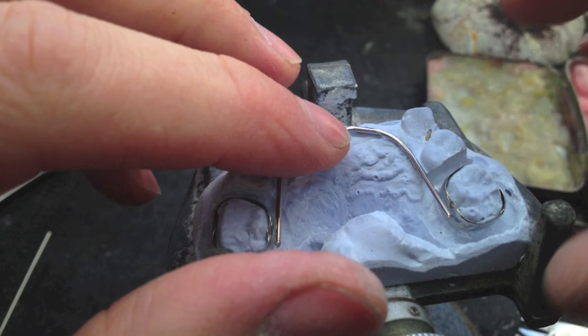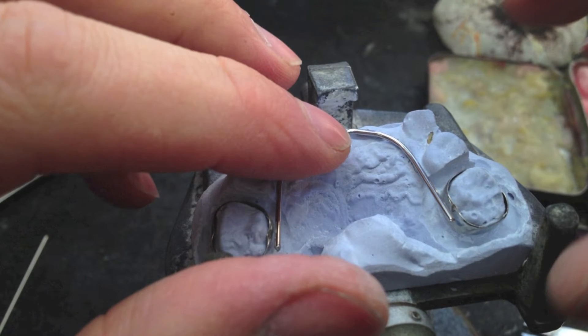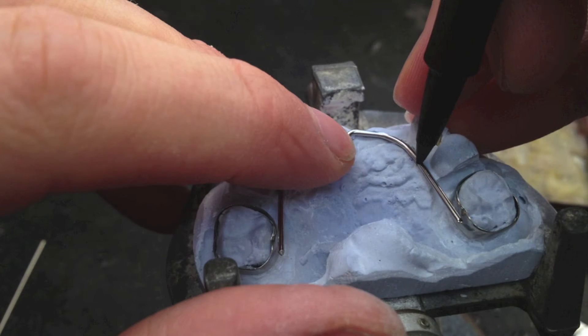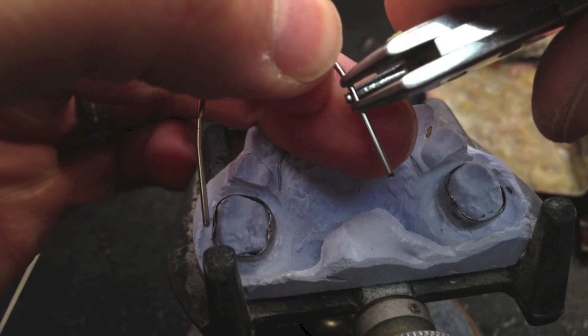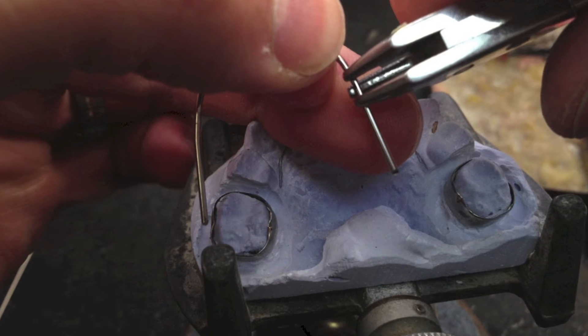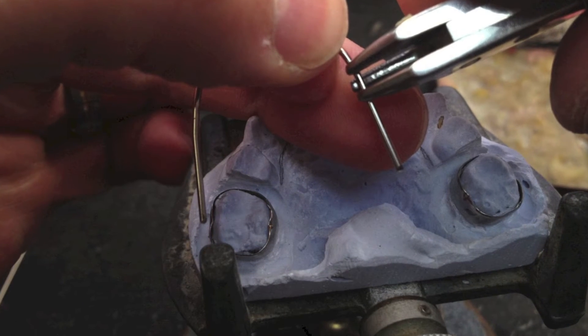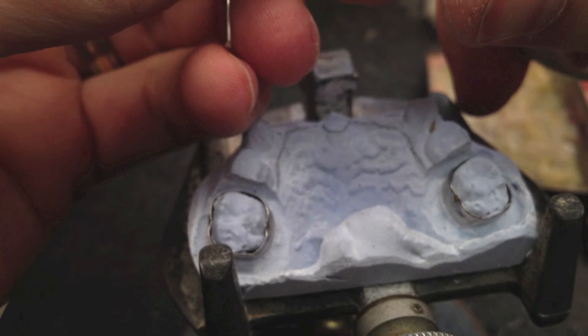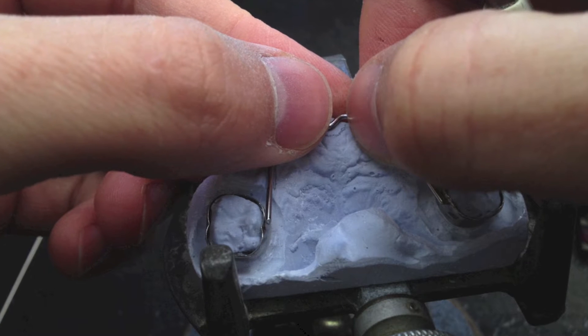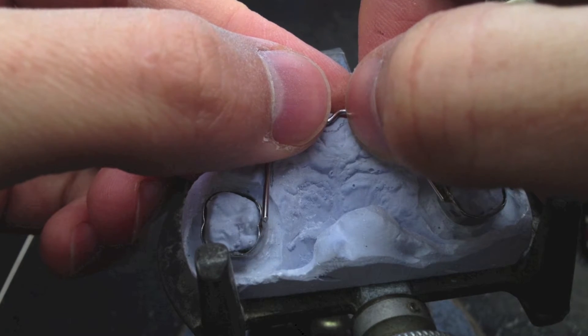As you can see, you're going to want a little space under the wire in the acrylic area so the acrylic can really get around the wire. If your wire is right against the tissue, you're not going to be able to get much acrylic under there, and there's a chance of this whole thing breaking off in the mouth — which is bad. So take a little time bending this wire, trying to get it where you need it to be.